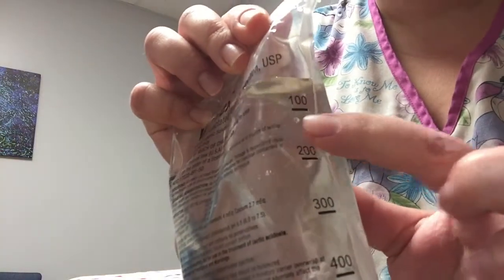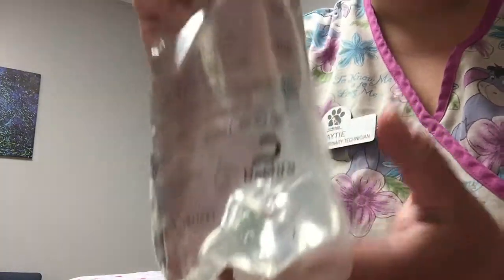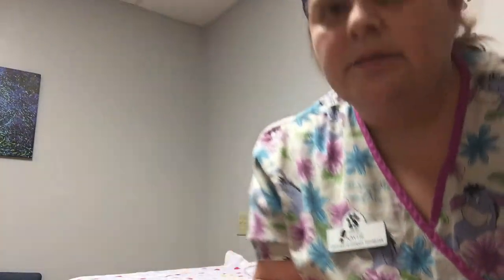The markings go 100, 200, 300, 400, and the rest of the bag to 500. Bigger bags go up to 1000, which is kind of cool. They also have smaller bags that go to 250, marked by 50 mLs — that works too.